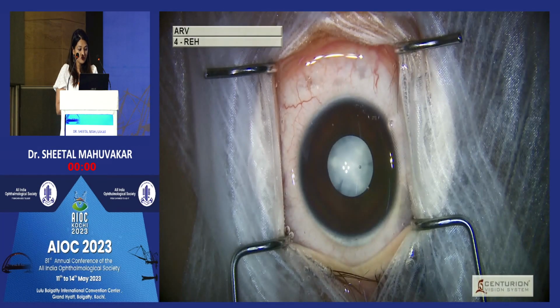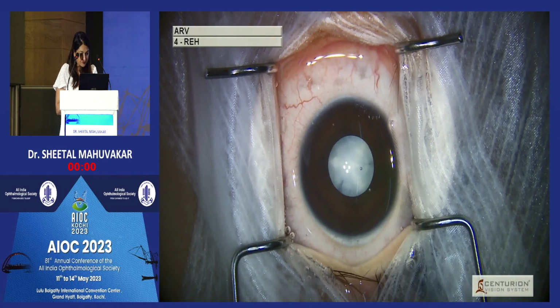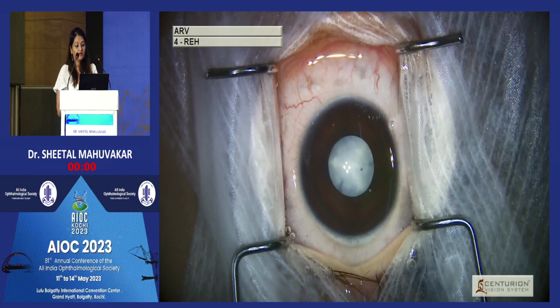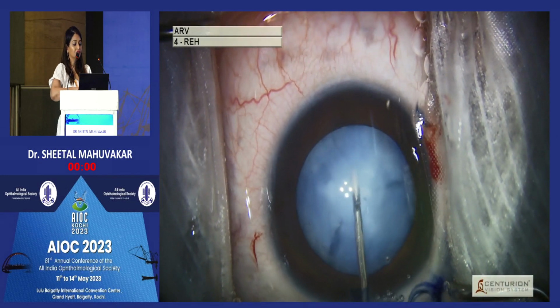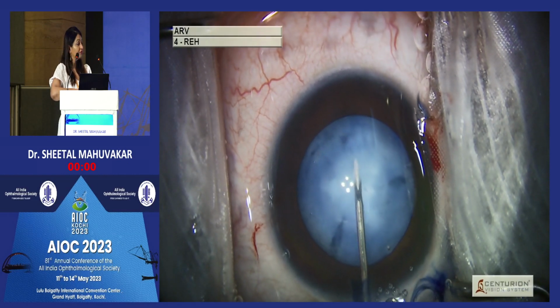I'll just play this small video. So, I can't forward it, right? Okay. So, basically, this video will show how the anterior capsulotomy is done.